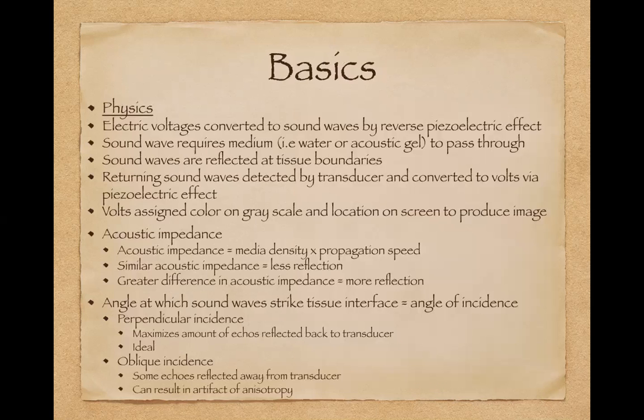So it wouldn't be an ultrasound lecture without some physics. The way that ultrasound works, there's electric voltage, which is converted to sound waves by the reverse piezoelectric effect. Those sound waves obviously require a medium to pass through, so we typically use an acoustic gel, but water can also be used. Then the sound waves are reflected at tissue borders and returned to the ultrasound probe, which converts those volts via the piezoelectric effect to be seen as shades on a grayscale on the screen and produce an image.